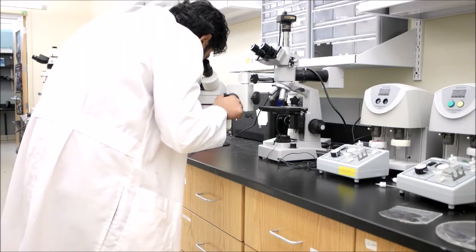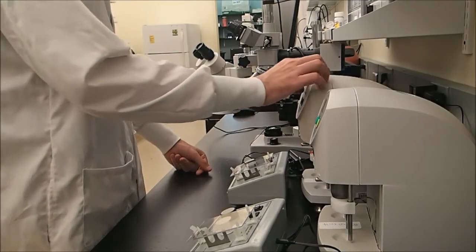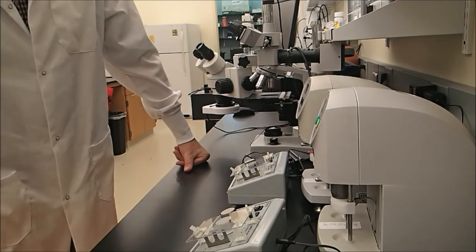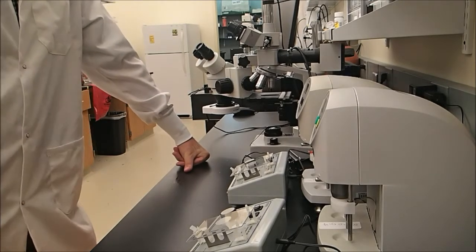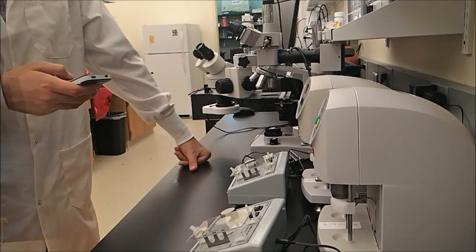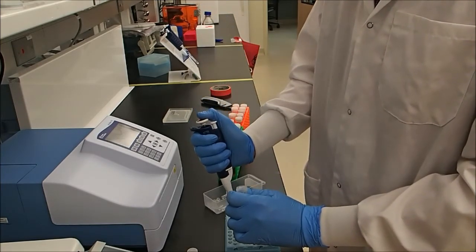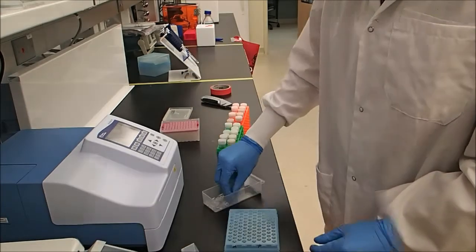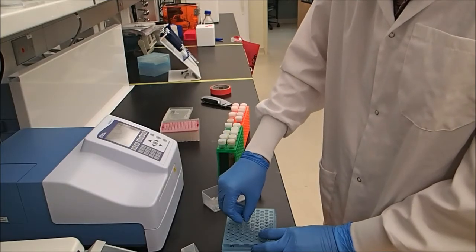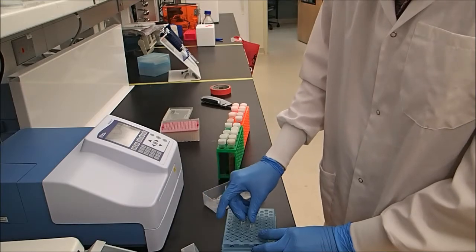Also, in the lab they do coagulation kinetics testing, which looks at the rate of how a blood sample coagulates. These tests are useful in preventative detection of patients with a high risk of stroke. The traditional testing method uses a thromboelastograph that measures changes in viscosity over time. In our technique, a technician places about 10 microliters of a sample in a capillary and measures the difference in volume as the sample coagulates over a period of time. The rate of change in this volume can be interpreted as the rate of coagulation.